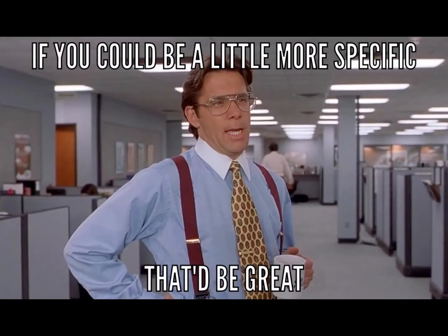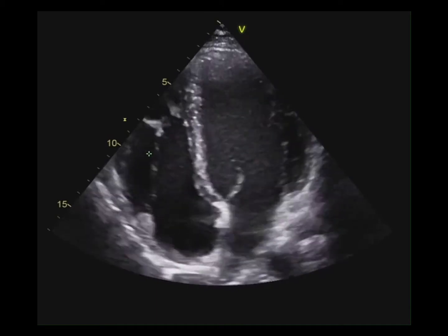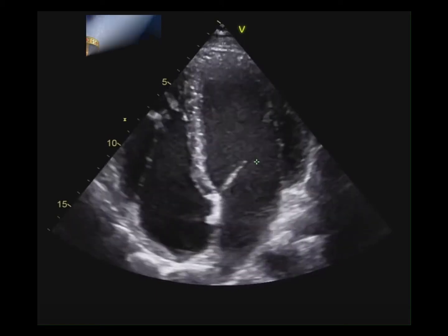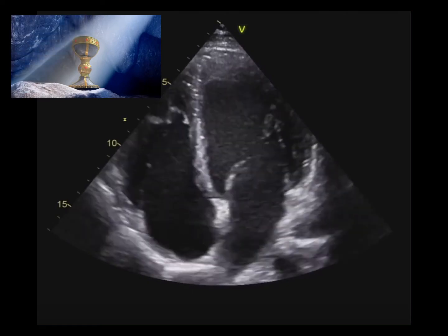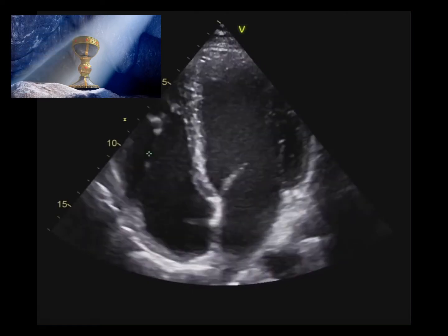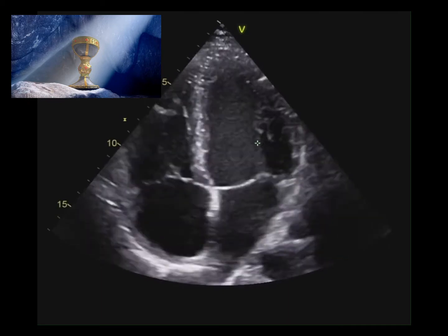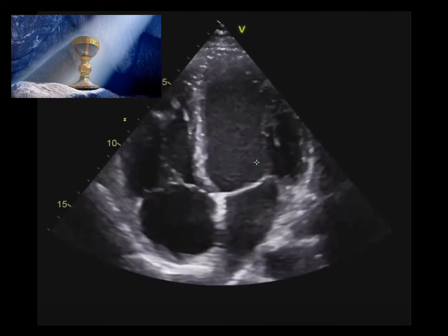What we need in these cases is to directly visualize right heart strain using ultrasound. You can visualize right heart strain in several different cardiac views, but the holy grail is naturally the most difficult to obtain — the apical four. This view lets you visualize the functionality of all four chambers simultaneously, as well as the overall motion of the heart on its axis.